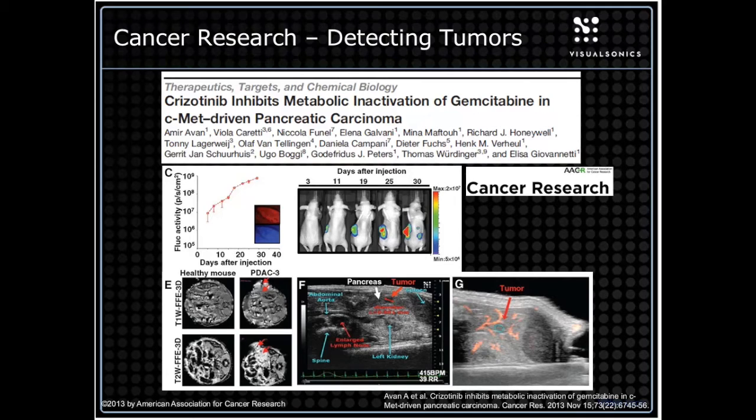On this image on the bottom right, you can also see red structures. These are larger blood vessels, because with the ultrasound detecting the echo, you see the anatomical structures based on density, but looking at a shift in those sound waves, you can also detect the motion. And suddenly you end up with information about tumor location, possible infiltration, tumor size in terms of volume, and also whether this tumor has larger blood vessels inside it. All of this very relevant information.